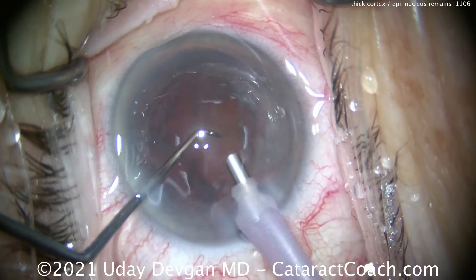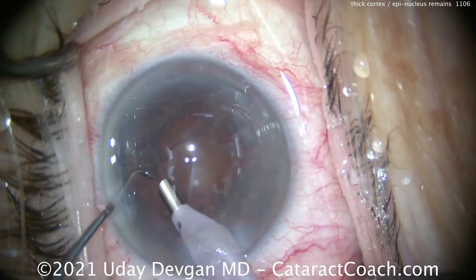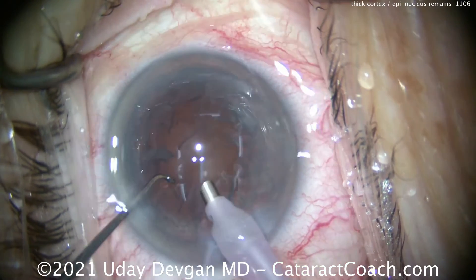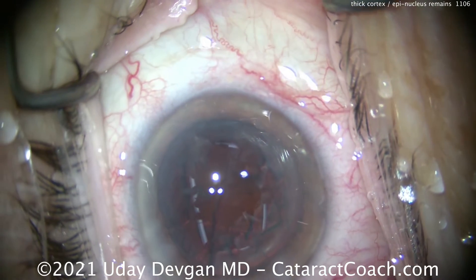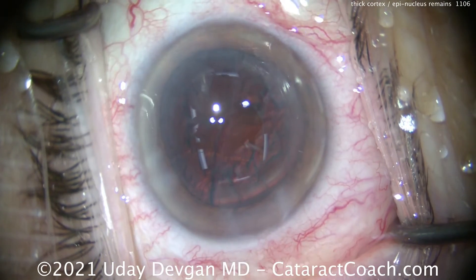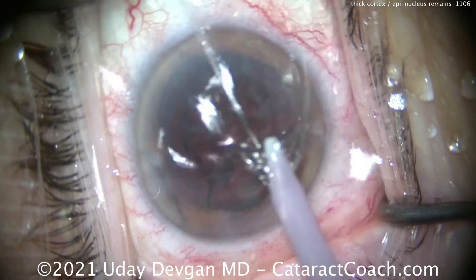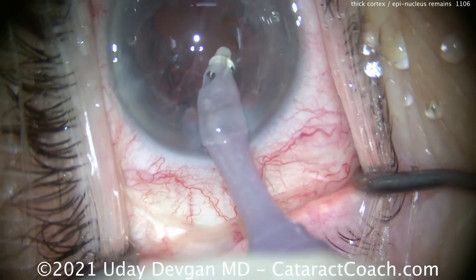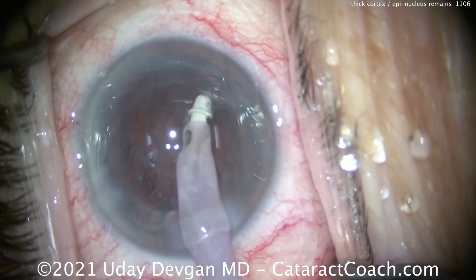We've had a video here on cataractcoach.com about cortical cleaving hydrodissection. So now the question is, what do you do? Do you try to get it out with the FACO probe? No, don't do that. Here's why: because you haven't loosened it up. This epinuclear shell is not released from the posterior capsule in the capsule bag. So let's go to the IA probe — it's a lot safer. It may not be as fast or efficient, but it's safer.